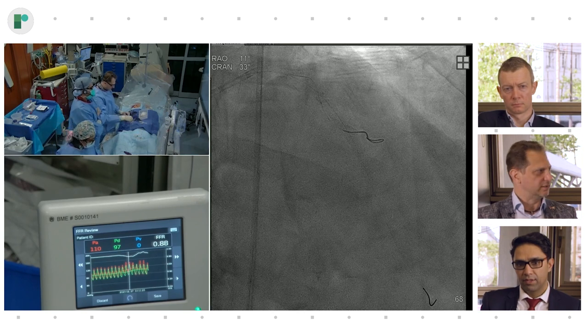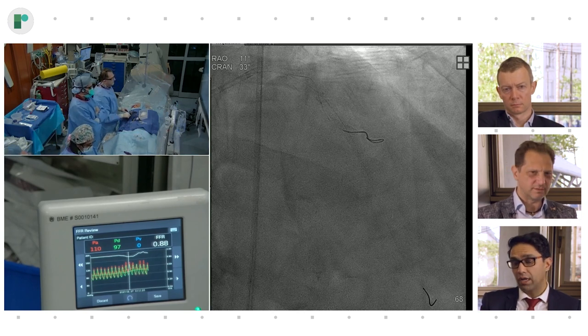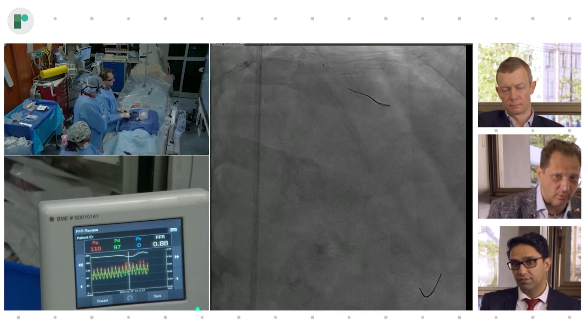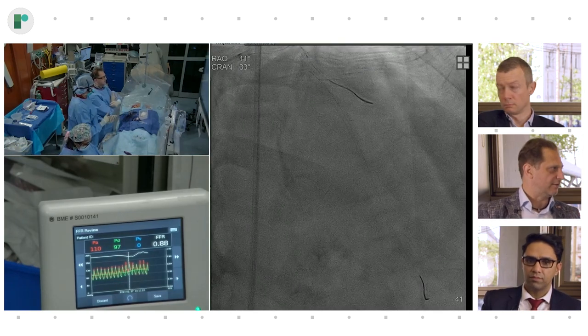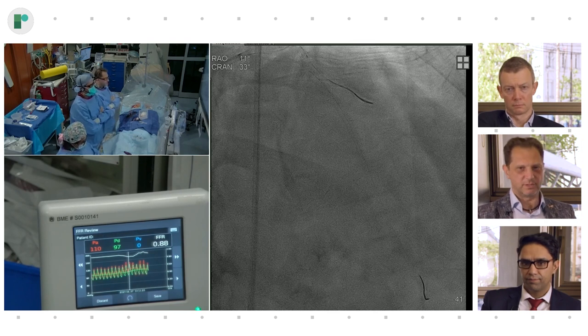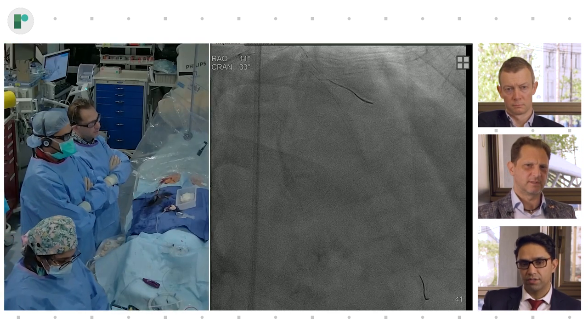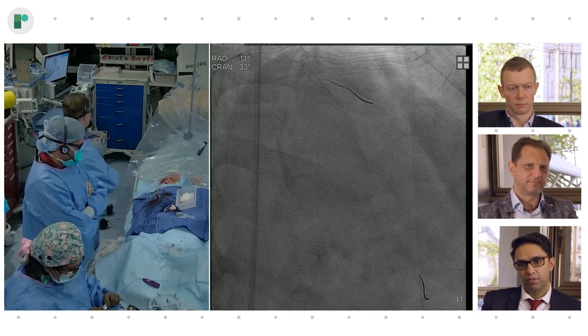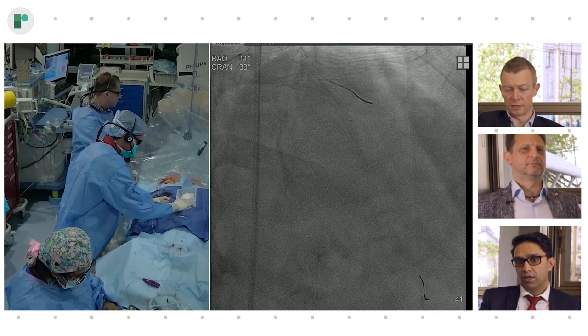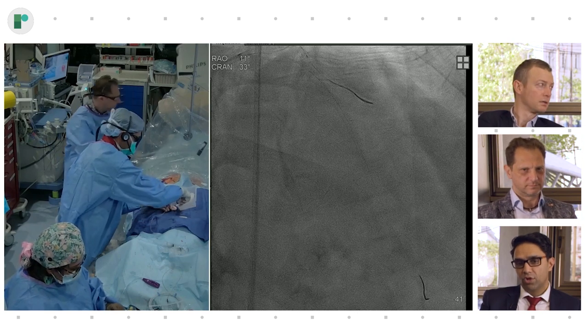I don't know if we did a little distal balloon dilatation, a little. Give drugs. That would be one option also here with the diffuse disease, like Joost said before, especially if you have a drug-coated balloon available, which currently we don't in the US. But here it's actually drugs. What is your first choice then here? Nitroprusside, adenosine, 2B3A, nitroglycerin.